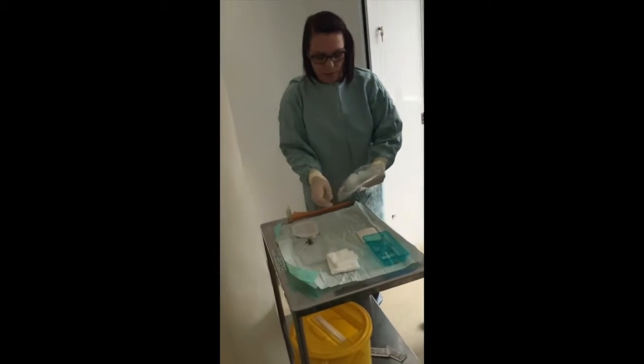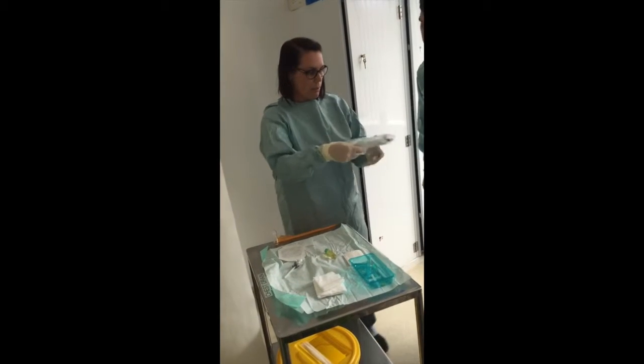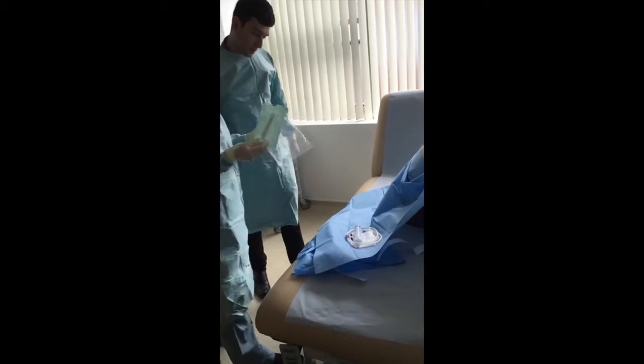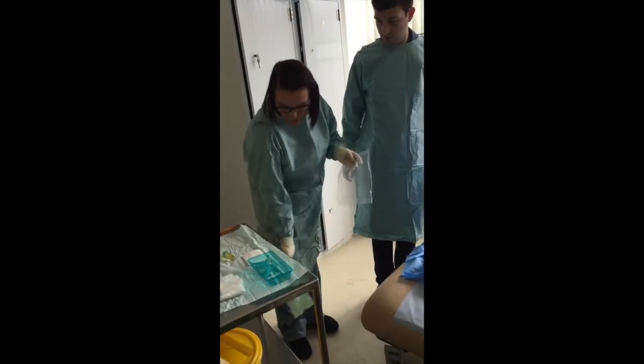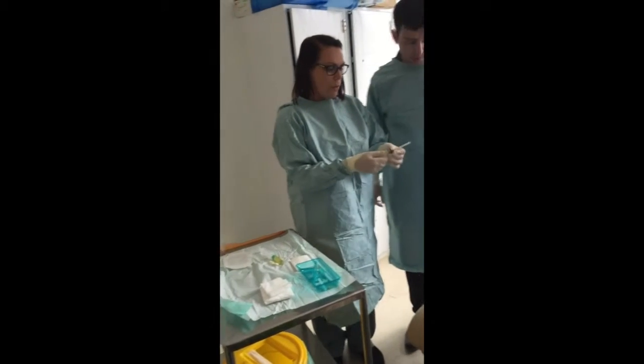So this is a pleural aspiration kit. What we're going to do is get that set up, so we're going to put that out on our sterile field ready to set up. We're not going to use the needles in this, we're going to use a cannula for safety purposes. And what we're going to use is a grey or a wide bore cannula.